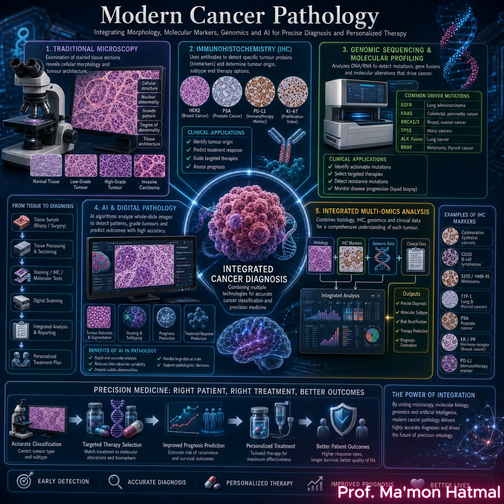Eosin stains the remainder of the cell and the surrounding tissues in different shades of pink, highlighting the cytoplasm, connective tissue, collagen, muscle, and many other normal structures. Together, these two colors create an extraordinary amount of information from a single tissue section.